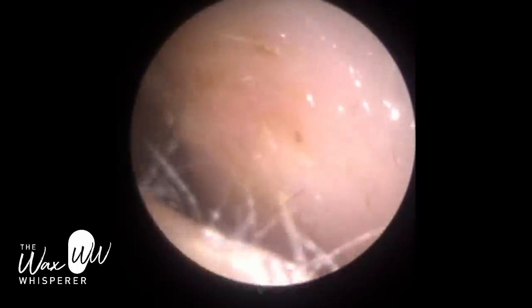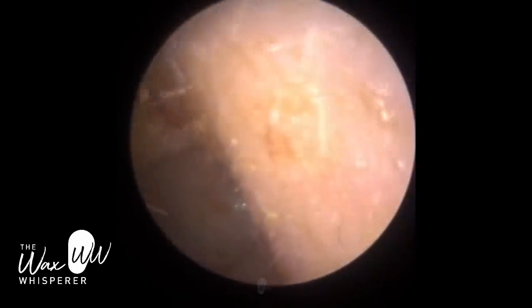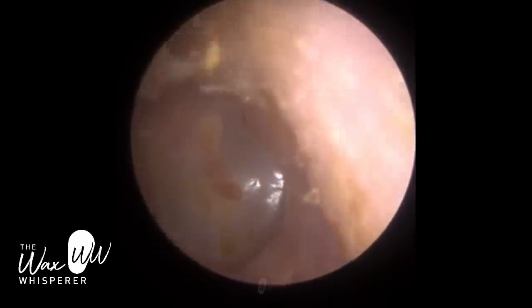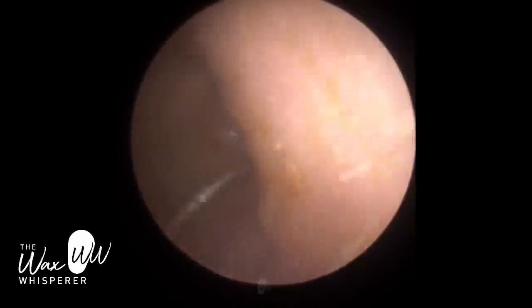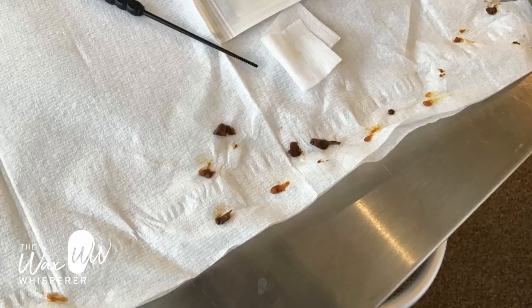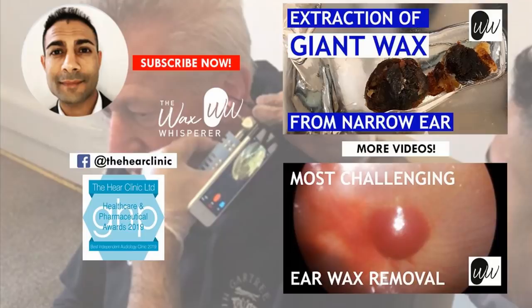The patient felt great after the procedure — she's over the moon. A lot of the wax, because it was soft, got suctioned up the suction tubing into the suction liner, but there were some big chunks that got trapped at the tip. I hope you enjoyed that video. I hope you're keeping well and safe wherever you are in the world. I'll have loads of new videos in due course. Take care.